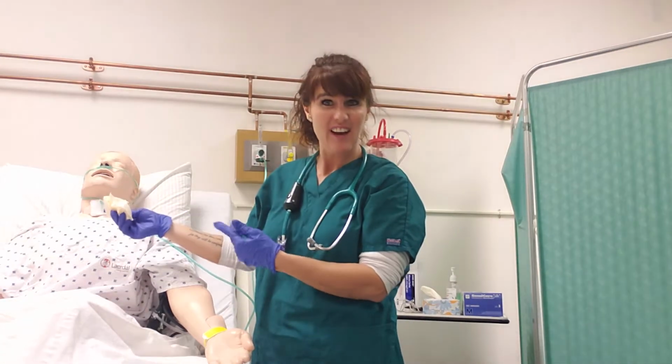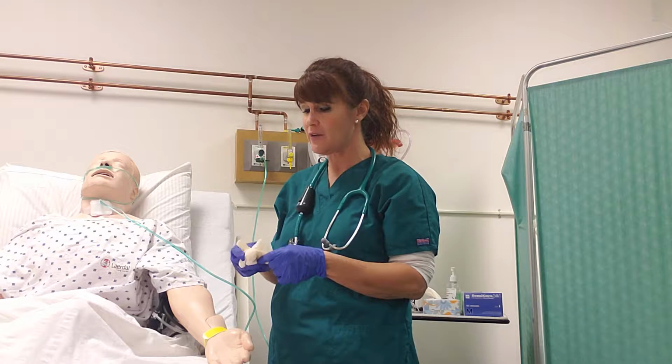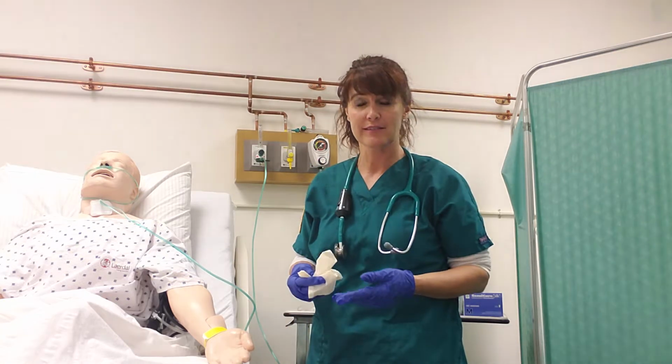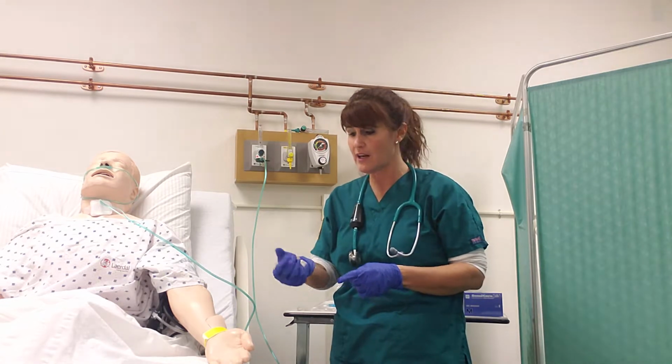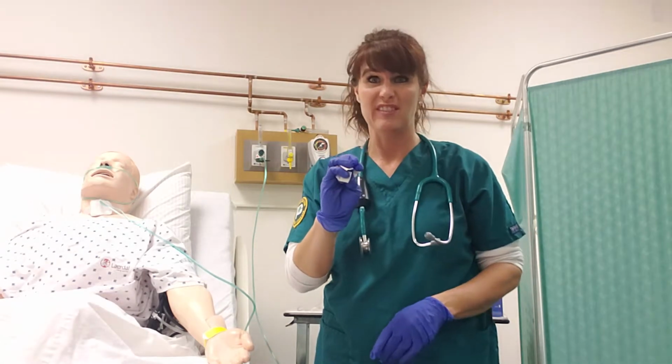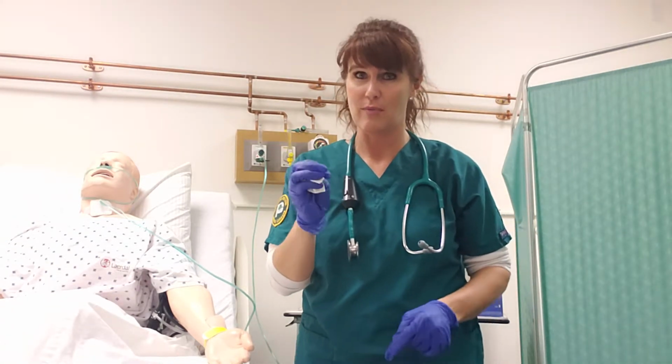Okay, so we pretend he does. If we get a lot of secretions out, then we're going to go ahead and look at it, maybe check the color, check the consistency. Gives us an idea if the treatment's working and we're getting the secretions moving. I'm sure the patient would have a sanitary replacement bag that we put this in. You wouldn't put it just in the trash because it's a biohazard.